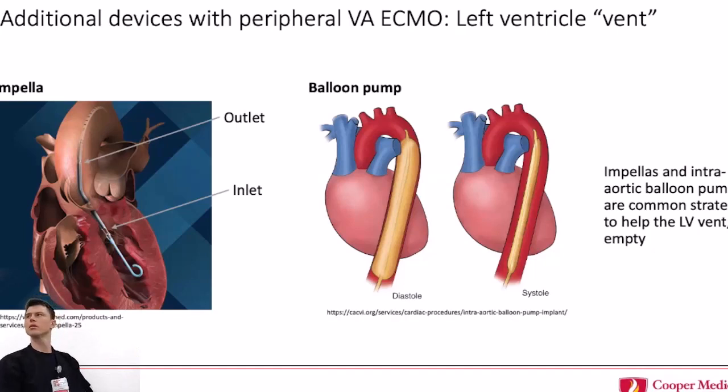One of the things you might actually see as the heart regains function is more alarming on your Impella, suction events and things like that, as the ventricle wakes up and starts to come in contact with the Impella. Some of you guys that took care of the patient in bed 1 experienced that a lot; it was similar to this.